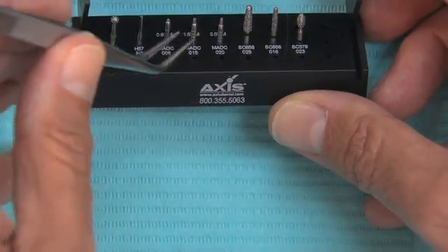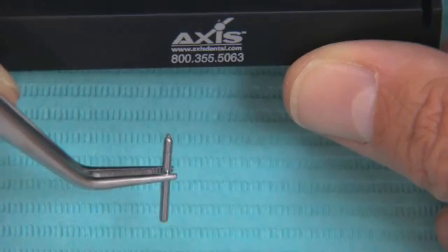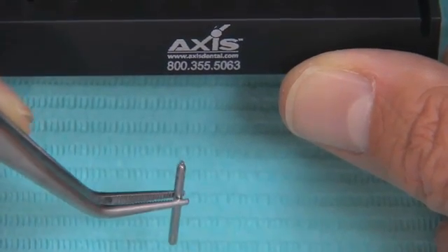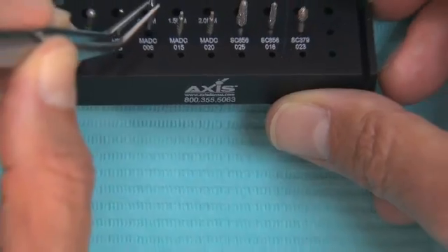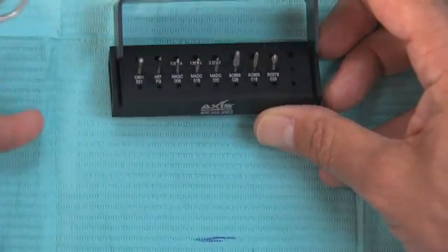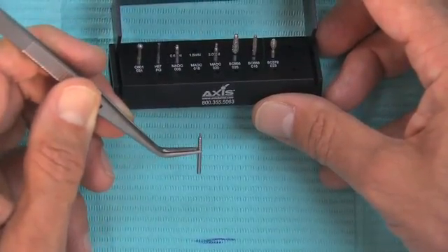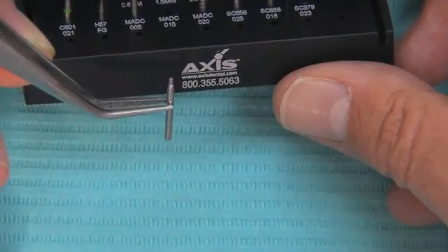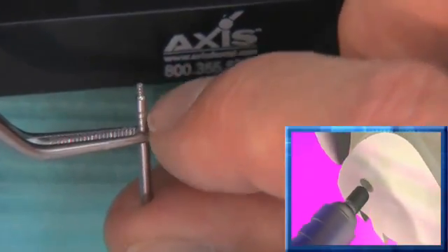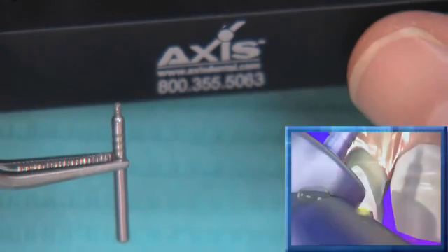Here are the depth cutting burrs. We have a 0.6 millimeter depth cutter used typically for veneer techniques — specifically minimal prep veneer techniques to keep within enamel — but it's not used in the crown and bridge technique demonstrated here. It is on the kit because this is the one burr kit I use for everything, whether cast gold, all ceramic, or PFMs. We also have a 1.5 millimeter depth cutter. These are self-limiting depth cutters — you can see where the diamond is on the tip, with a shelf right below it. When pushed into the tooth, it stops — you cannot push it in too deep.